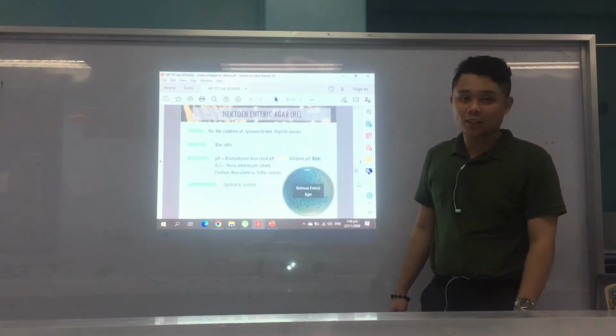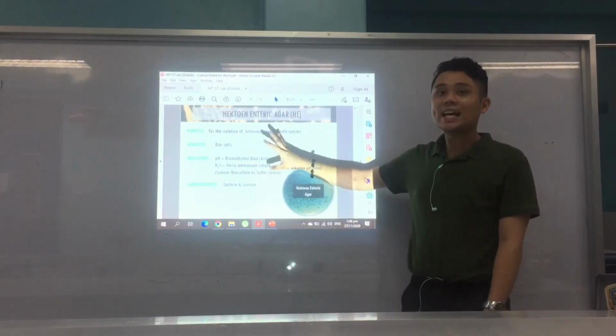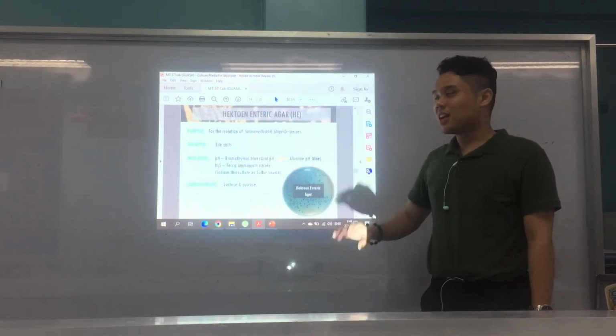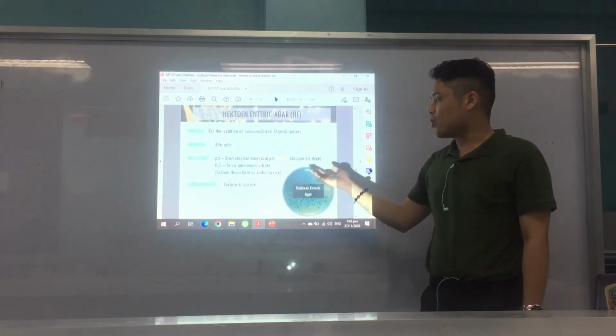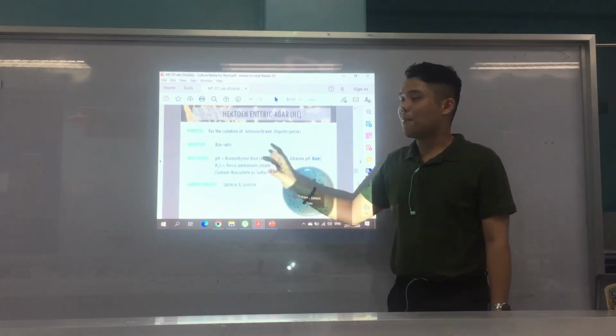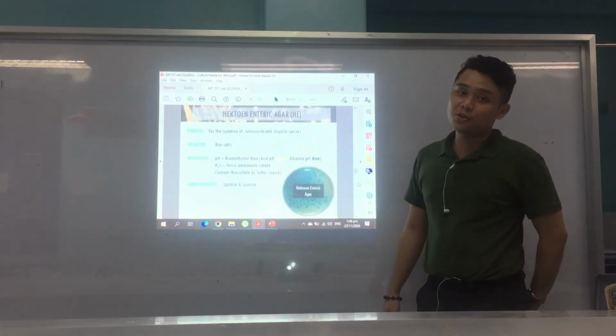Next one, we have Hektoen enteric agar. Still the same for the isolation of Salmonella and Shigella species. I like this culture medium kaya ganun ko siyang color. Inhibitor niya is bile salts. Indicators this time will change: bromothymol blue. Acidic pH is still yellow. Alkaline pH is blue. For H2S, it's ferric ammonium citrate ang mo-combine to form the precipitate.